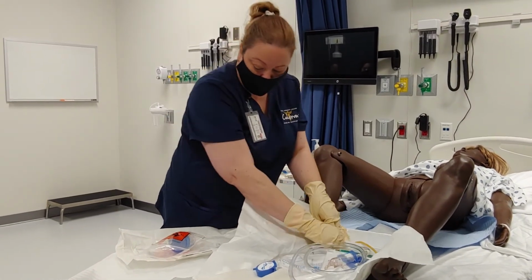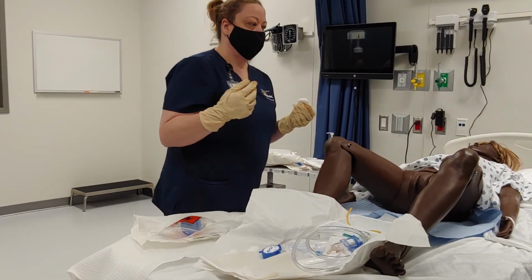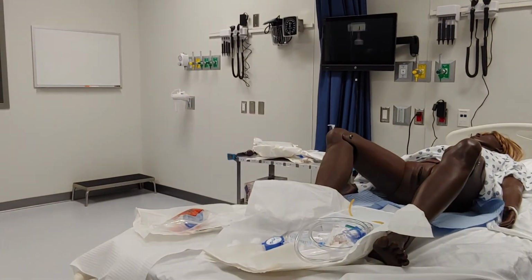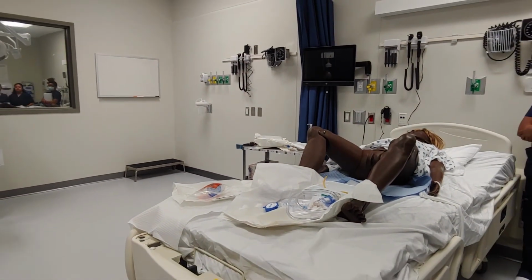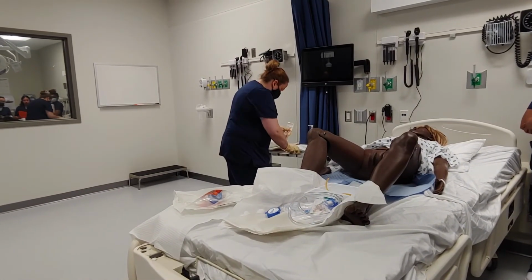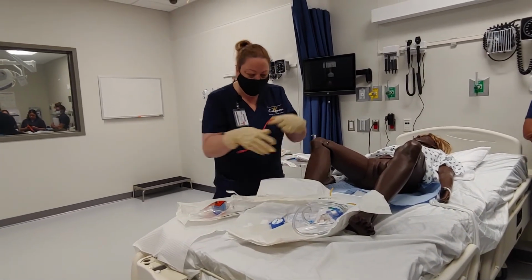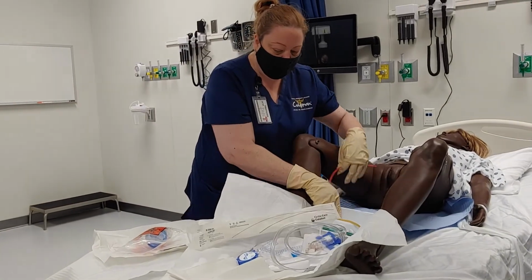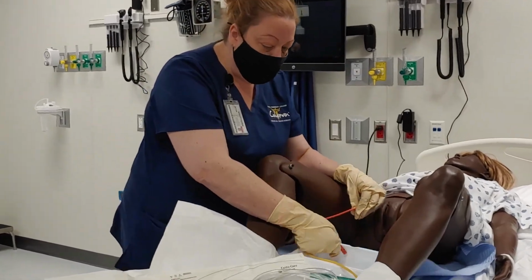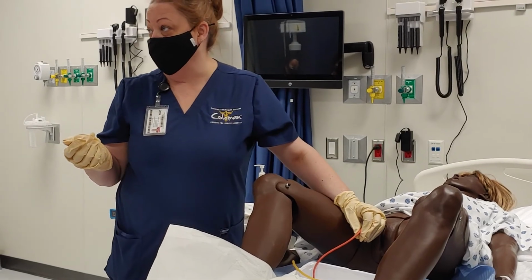Now, the only other thing I want to show you is that when you're doing a straight catheter, what you're going to do is, once I have inserted it in, I'm just going to show you really quick. You won't have all this stuff with you. It may come with a little tray. Open end, nothing there. When you put it in, that end had better be in some type of receptacle or you're going to have a very big mess on your hands, okay?